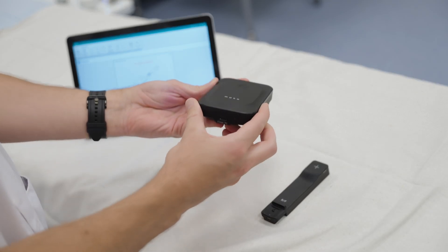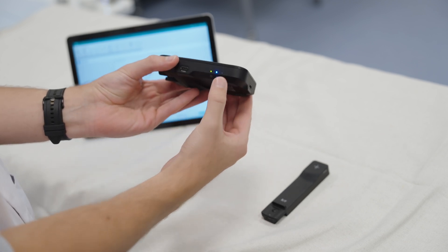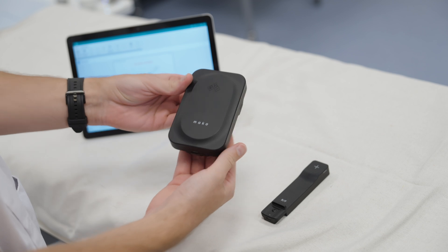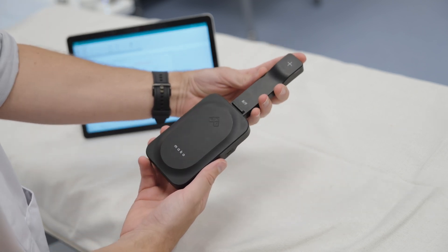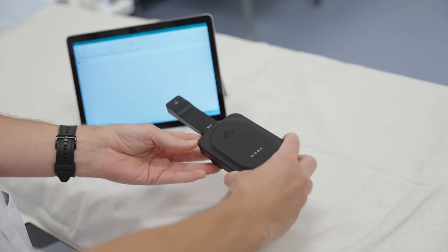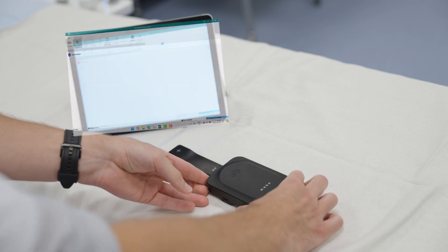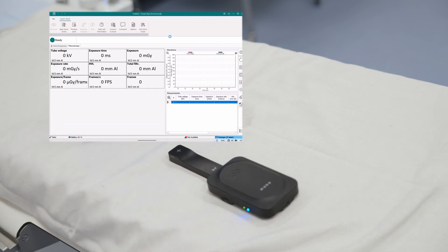To set up and measure KV, dose and pulses in fluoroscopy applications such as interventional, cardiovascular and surgical systems, first switch on the Mako base unit. The solid green light will display. Connect the Mako RF probe to the base unit. Mako auto-connects to the display device via Bluetooth, shown by the solid blue light, which unlike other sensors allows a fully wireless setup. The intuitive Ocean software displays measurement parameters from Mako. The system is now ready to measure.